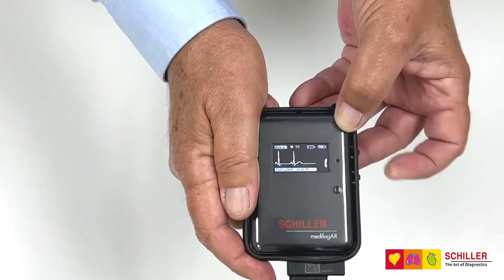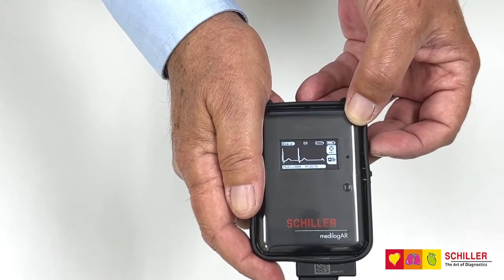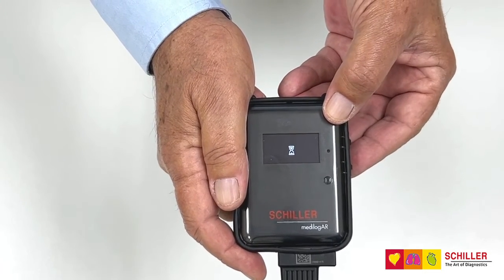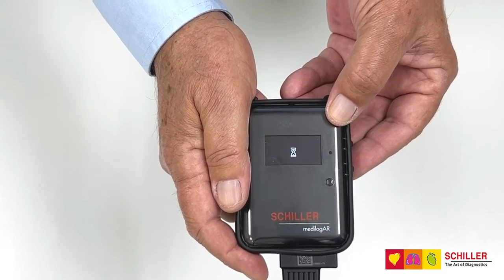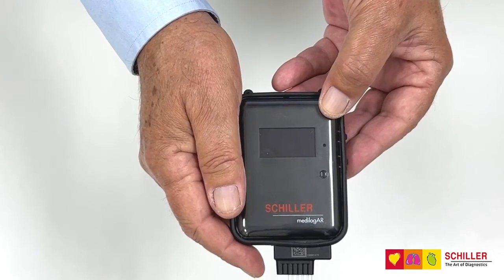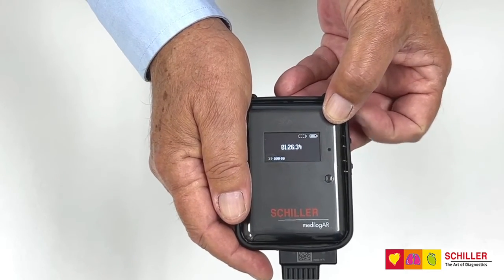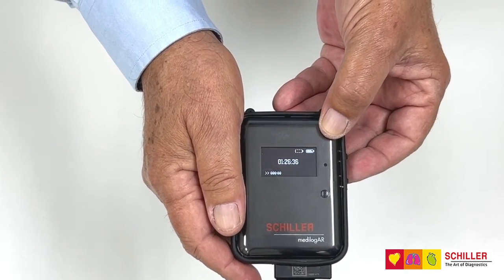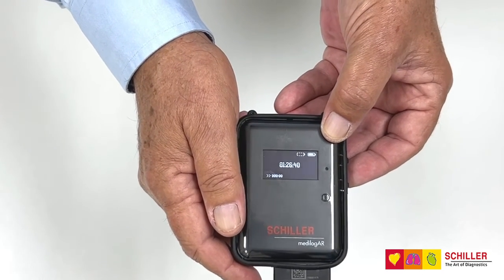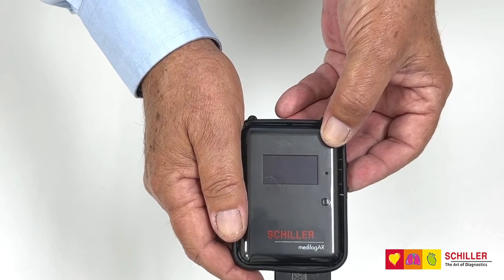Again, the lower button to check channel 3, and once you have this done you just press the upper button. The machine will immediately start the recording and the screen will go blank. When the patient presses any of the buttons, it will immediately show the time of day so that the patient can record on the diary the symptoms they had at that moment.